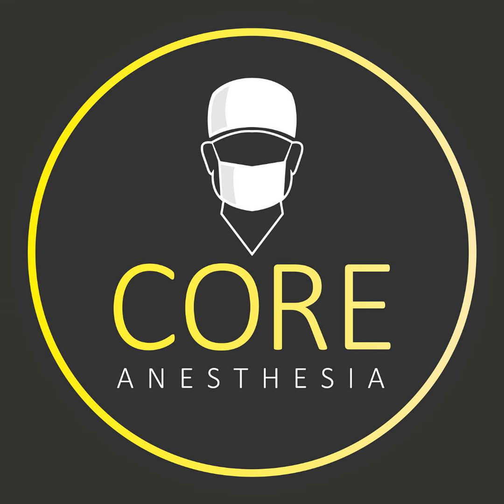So if you have a Mac blade, and regardless here, I should back up a second, regardless of which blade you have, the goal is to somehow now move the epiglottis out of the way to expose the vocal cords that are going to be hiding behind the epiglottis. And it's going to be on the highest part, the superior part of your view when you move the epiglottis out of the way. So what happens then is, depending on which blade you have, so let's talk about a Mac blade first. So this is the curved blade.